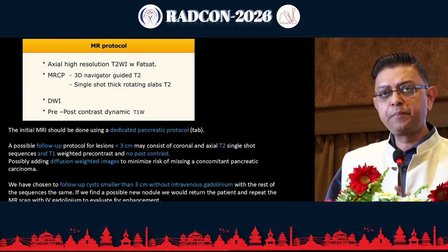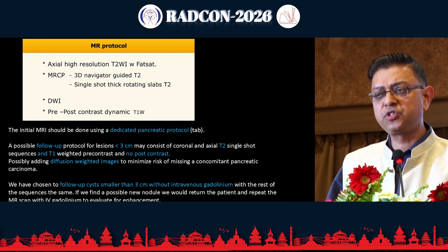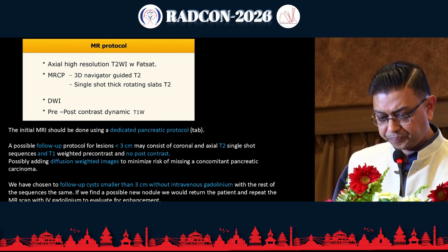So what is an MRI protocol? If we use MRI, it is very similar to any abdominal case which you do on MRI. You take similar sequences, and you, of course, do an MRCP. You take thin slices. You may or may not use post-contrast images.